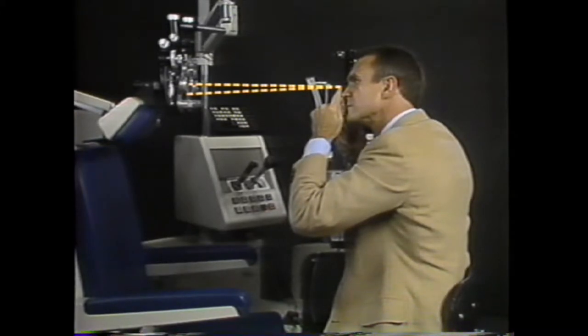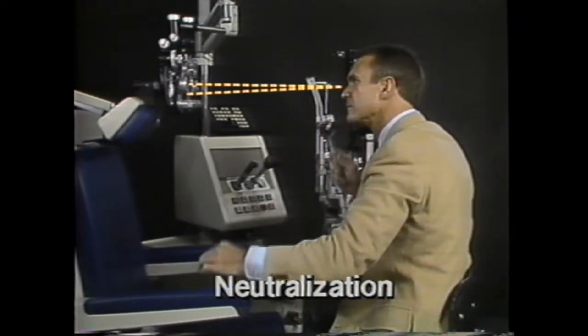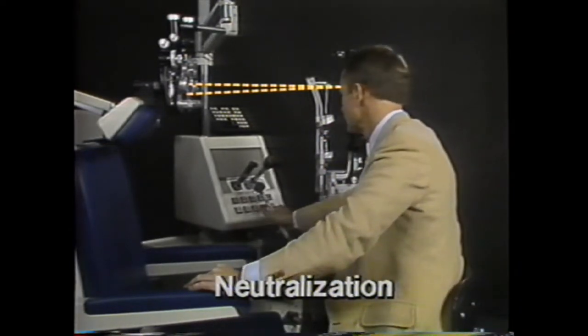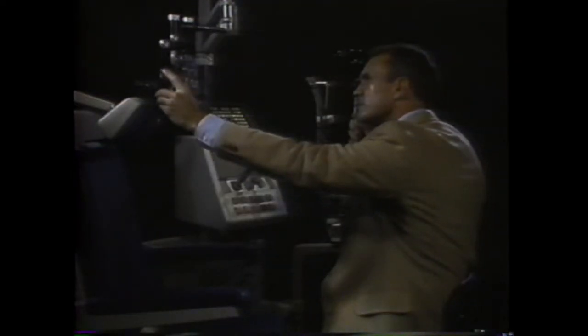When the far point reaches the retinoscope, the reflex becomes neutralized, filling the whole pupil and no longer moving. Dr. Guyton will look at a reflex and move the far point around by changing the lenses. Here's with movement — the far point must be beyond the retinoscope. That says add plus, dial down on the phoropter to pull the far point inward toward the retinoscope.